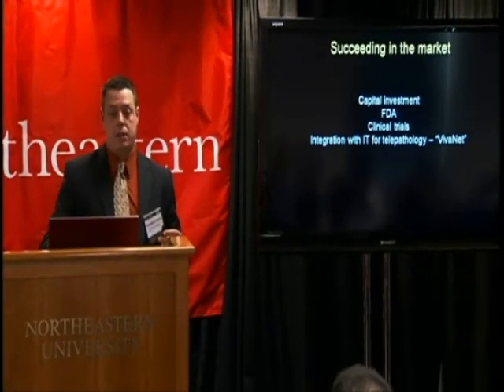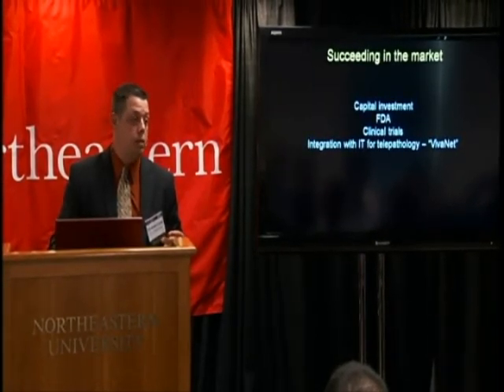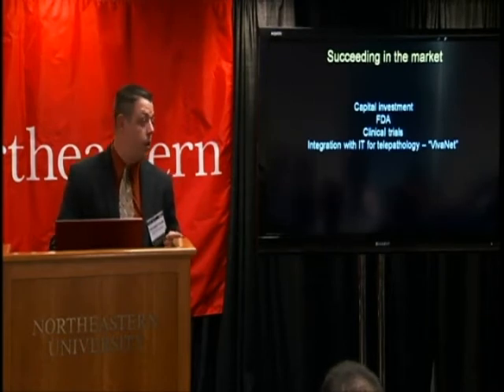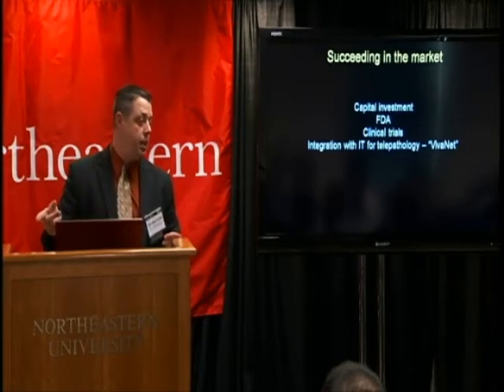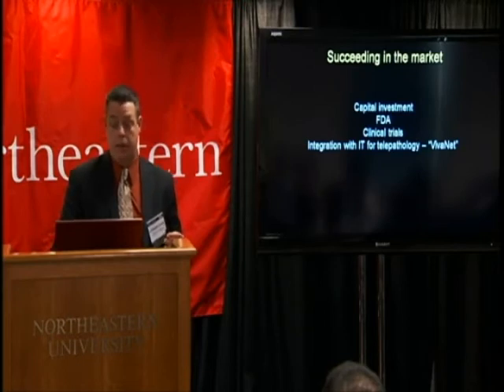This allows us to collaborate in near real time, allows more facilities to be involved in the clinical trials, and really results in much better work. Some of the most noted work has been done between Modena, Italy, and our friends in the Sydney Melanoma Institute using a VivaNet-like system.